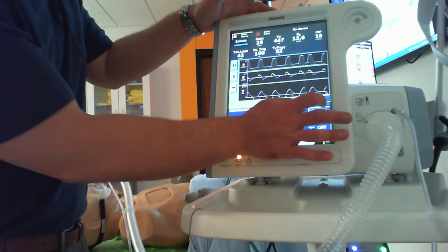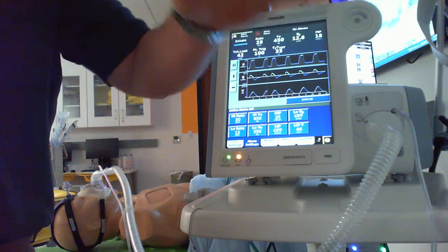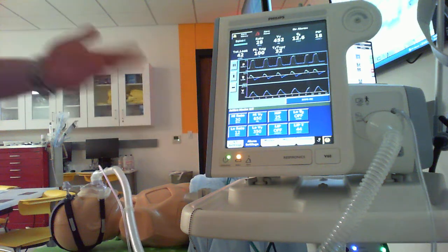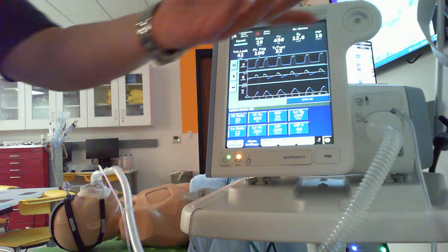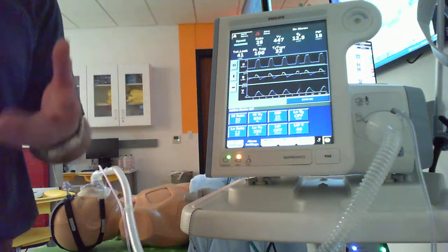Now keep in mind, be warned, if I set this at 20 and then I start making some changes, as I make changes, if I hit my pressure, it's going to start freaking because it's going to start down-regulating the pressure, okay? So you got to make sure you give yourself enough room to work. So if I had this patient on 10 and 5 and I set this at 15 or 20, as soon as I hit my set pressure at 15, it's going to dump if that's what I have the alarm set at. So you always want it higher than what pressures you're trying to target, okay?